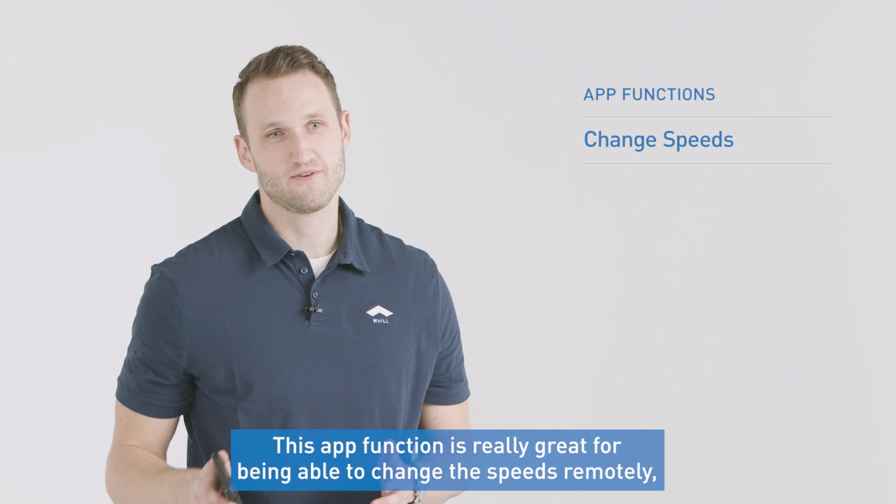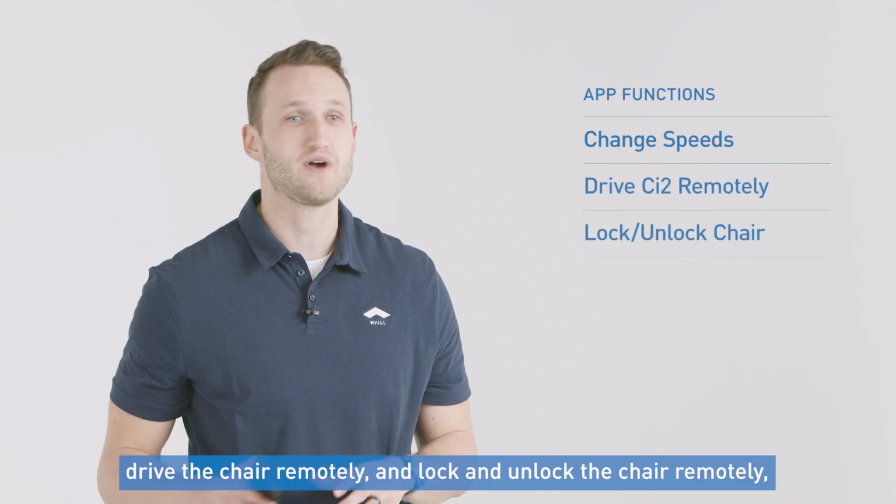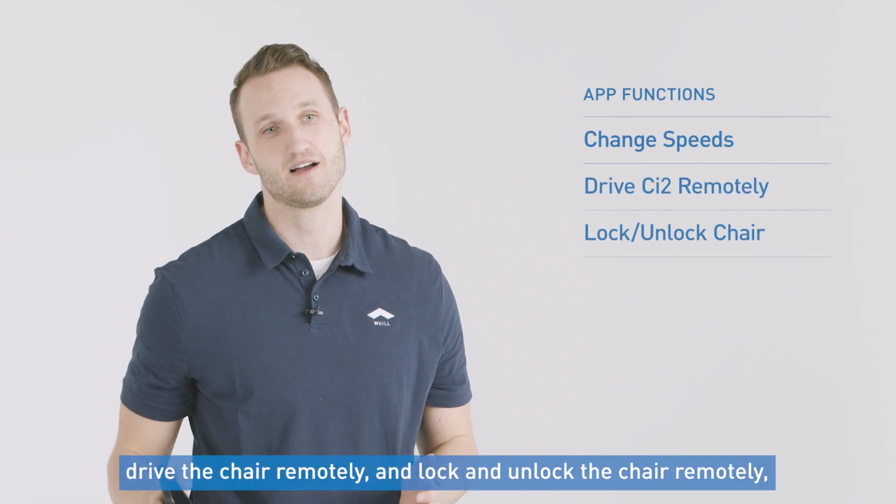This app function is really great for being able to change the speeds remotely, drive the chair remotely, and as well lock and unlock the chair remotely using your Android or iPhone app.